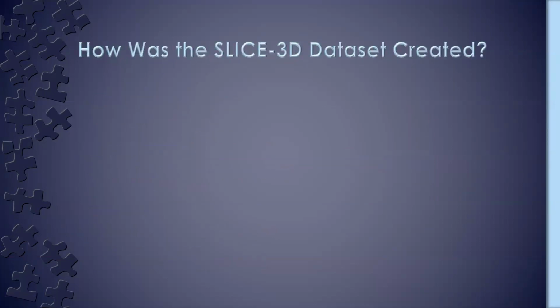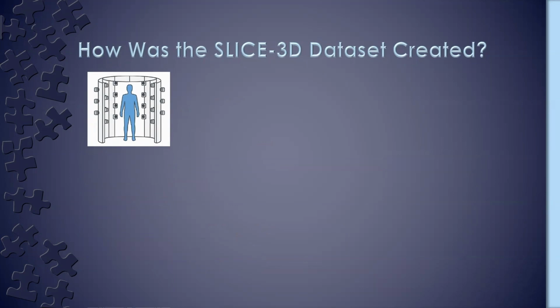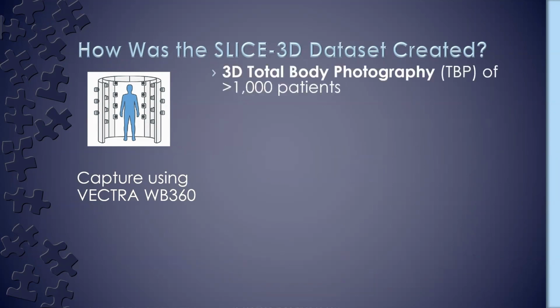How was the SLICE-3D dataset created? The SLICE-3D dataset was built using a system called Vectra WB360, a specialized imaging ring made of 92 DSLR camera arrays around the patient to capture the entire body in high resolution from all angles. This is a scan called 3D total body photography, or TBP. Over 1,000 patients were photographed this way across 7 clinical centers worldwide.